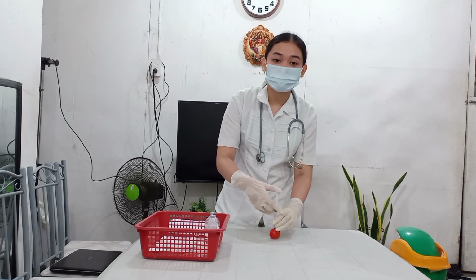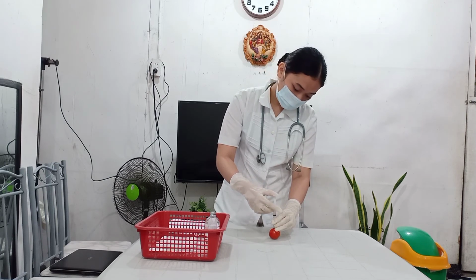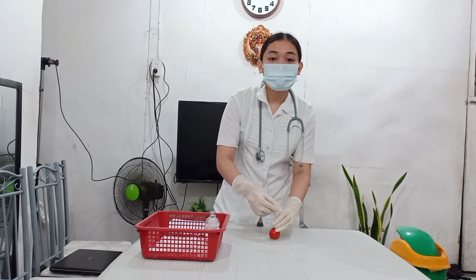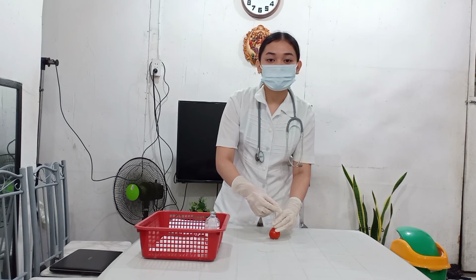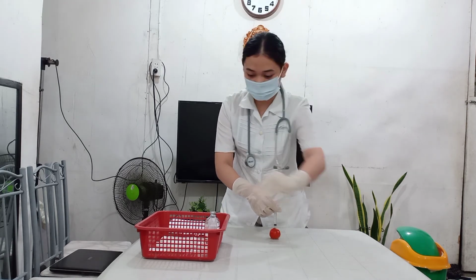Next is we slowly inject the medication. Rapid injection may be painful for the client. Injecting slowly reduces discomfort, allowing time for the solution to disperse in the tissues.